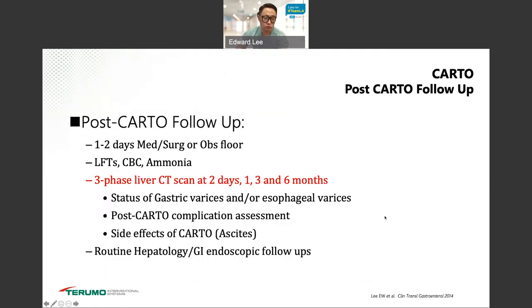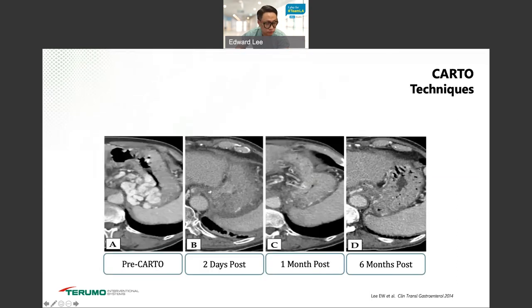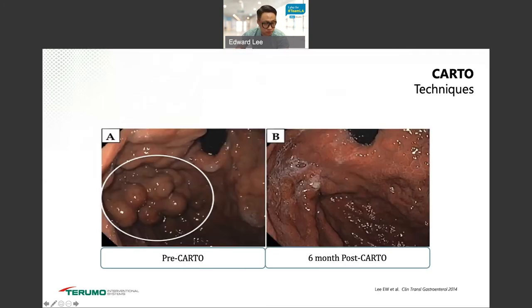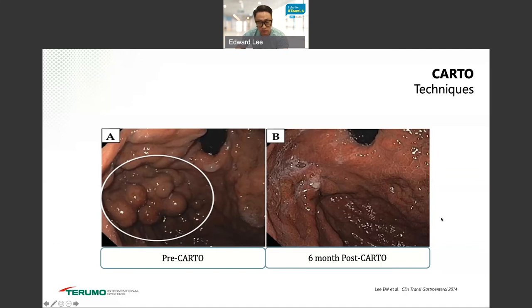Post-CARTO follow-up: one to two days in monitored care or floor. Triple-phase CT is done to check for complications and confirm status of varices. Then routine hepatology and GI follow-up every three to six months. Here's a CT showing pre-procedure gastric varices and shunt; three days after CARTO, completely obliterated and disappeared; one month and six months later, complete obliteration — this patient never bled again. On endoscopy, the gastric varices in the fundus that were about to rupture are completely obliterated and gone six months after CARTO. Your endoscopy and hepatology colleagues will be shocked at how completely they disappear.